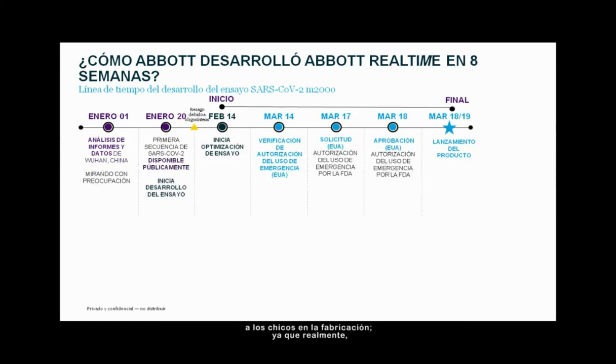And I want to tip my hat at this point to the guys in manufacturing, who really had to step up to meet the demand and do it in really quick time as well. So we did that reformulation and got ready for EUA verification studies by March 14th, and then EUA submission. And again, tip my hat to the FDA for making this channel open and for working so quickly to get this done in like a 24-hour turnaround and then getting this launched. So this was a whirlwind, as you can imagine.